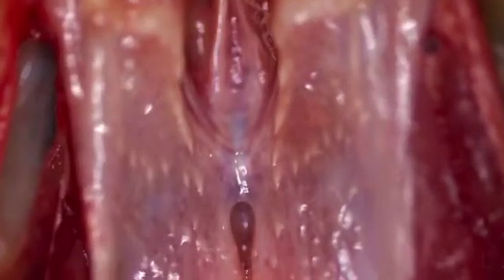Just caudal to the choana is the infundibular cleft. This is the opening to the eustachian tube, and is surrounded by ridges and rows of sharp, well-demarcated papillae that point caudally. A variety of diseases can damage the papillae, resulting in blunting.